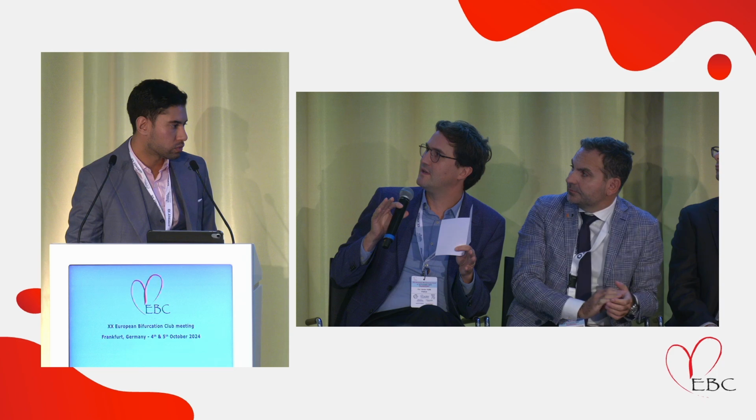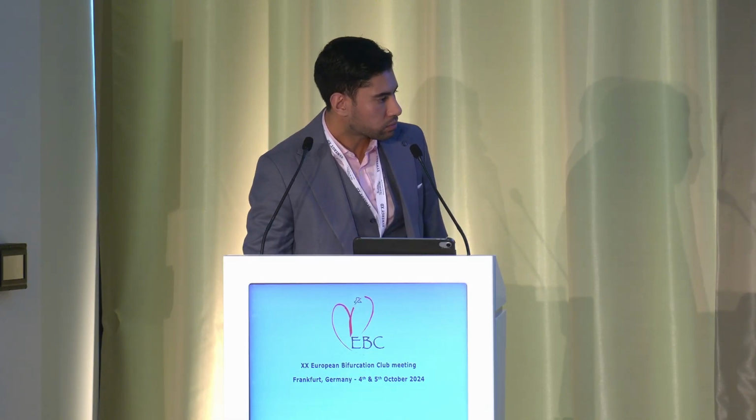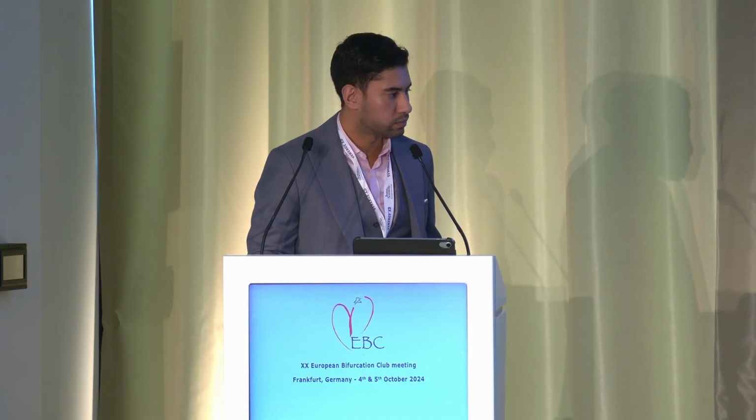The bench model that you have is rigid, right? The walls. Somehow rigid, yeah. Because you don't see the effect of 3 overlapping balloons, which, if it were not rigid, would deform the proximal part as well. You see what I mean? If it's constrained. Yeah, because we could not exceed the size of the model itself, while the vessel itself could, we could overstretch it, which could lead to more deformation.